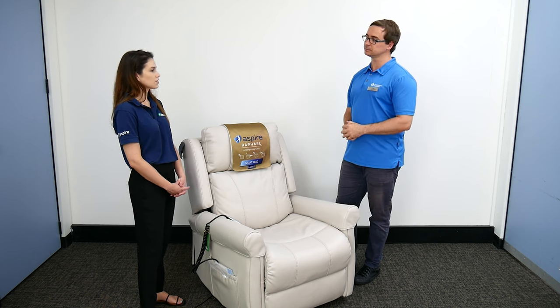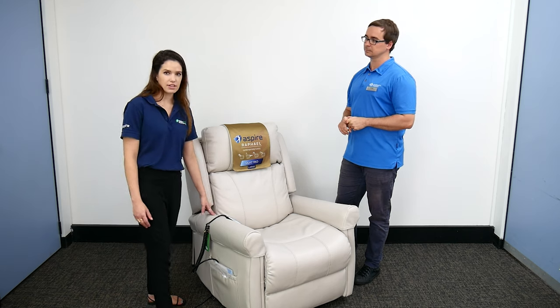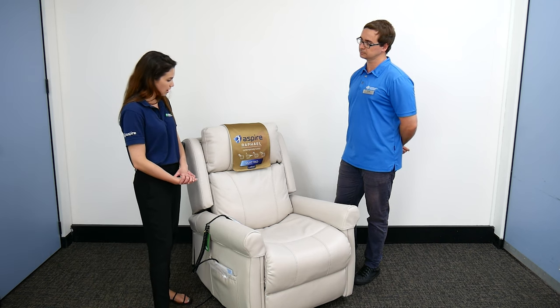The safe weight limit for this chair is 130 kilos. We do have other sizes available — the Maxi chair has a higher safe working load.